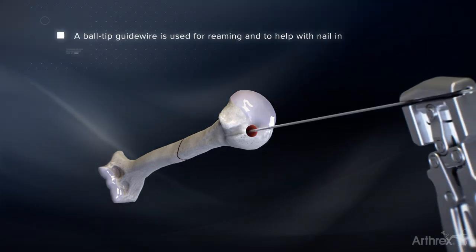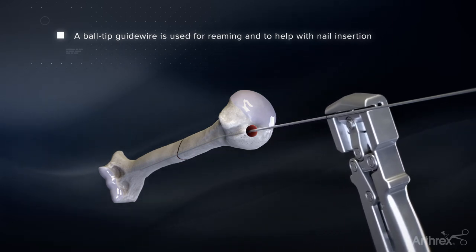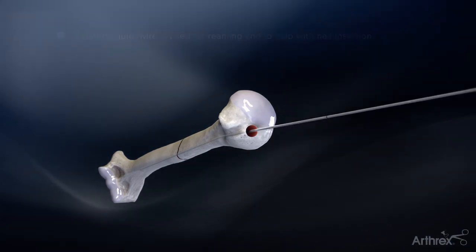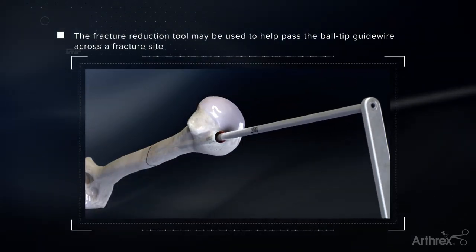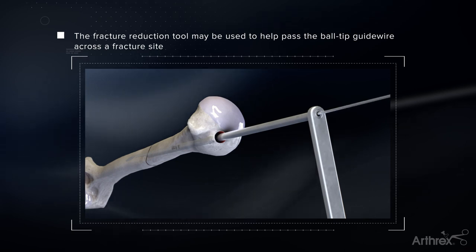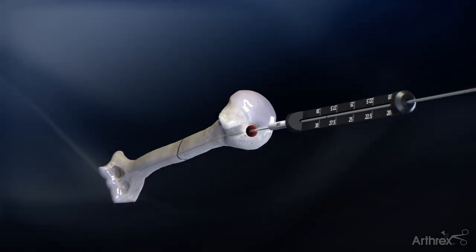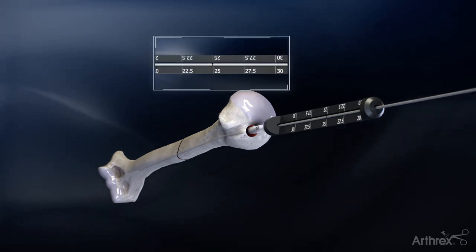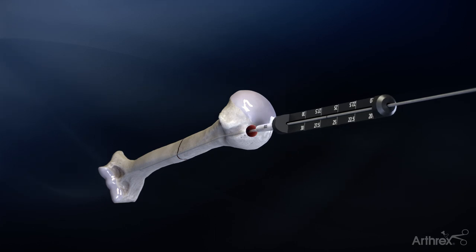Insert the ball tip guide wire if canal reaming is desired, making sure the tip of the wire is just inside the condylar flare. If the fracture is displaced, the fracture reduction tool can be used to help pass the ball tip guide wire down the humeral canal. Utilizing the guide wire measuring gauge and black line on the guide wire, determine the length of the nail needed. If in-between sizes, it is recommended to size down.